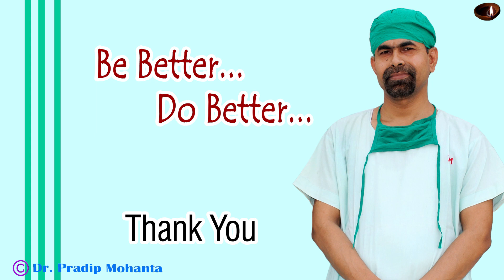A few drops of moxifloxacin are applied to the ocular surface and the case is concluded. Thank you very much for your attention. Hope this video will help you in developing your surgical skills. Be a great surgeon and serve your patients with love, respect, empathy and great surgical competence.